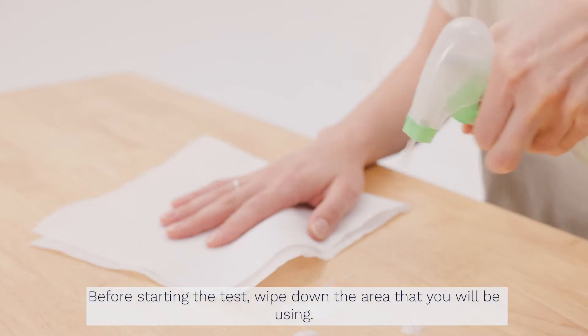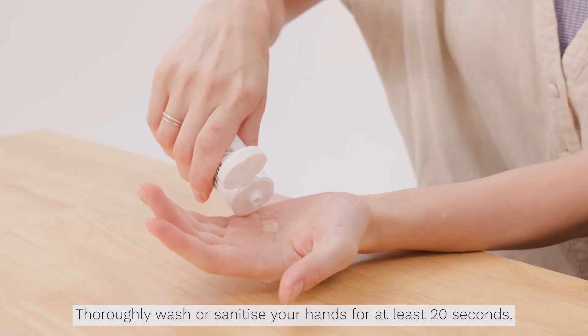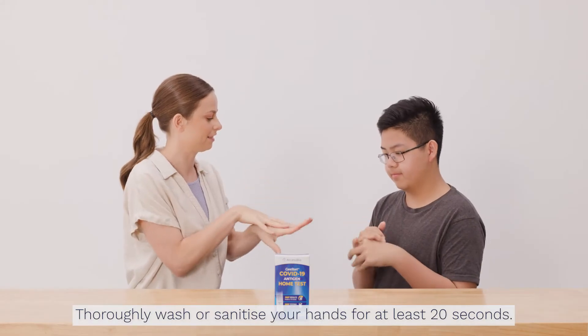Before starting the test, wipe down the area that you will be using. Thoroughly wash or sanitize your hands for at least 20 seconds.